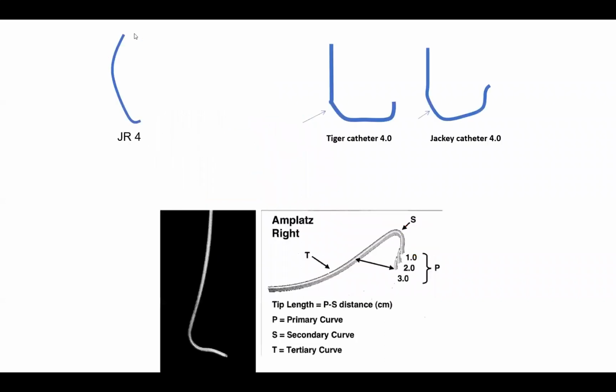Those are the catheters. So this is the standard Judkins right 4. We almost always use Judkins right 4. We very rarely use Judkins right 5, unlike on the left, with Judkins left, where we frequently use the whole spectrum, 4, 5, even 6, and 3.5.